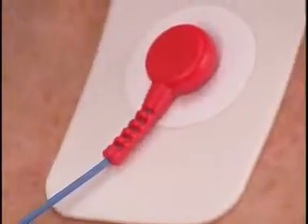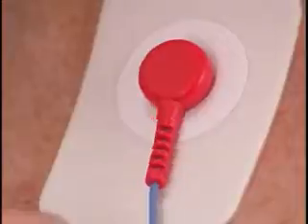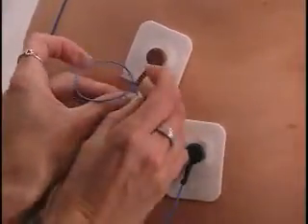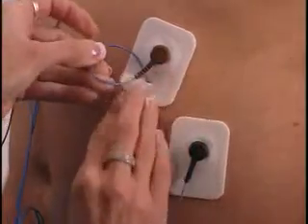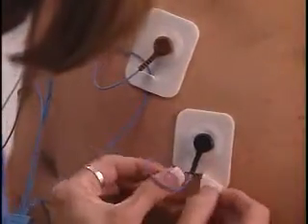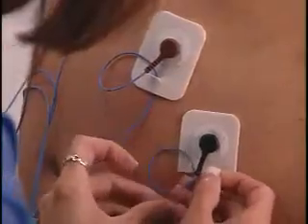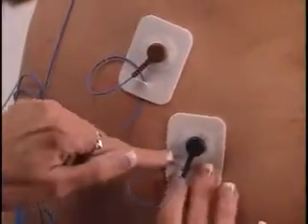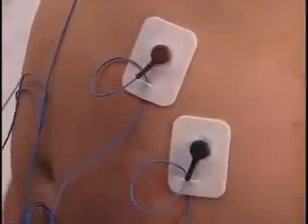It does not matter which way the electrode is pointing. Each electrode has a small slit on the bottom left side of the electrode to allow you to create a stress loop. Adding the stress loop at each site will lessen the chance of the wire disconnecting from the electrode due to movement and reduces artifact if the leads are pulled or tugged during normal patient activity.